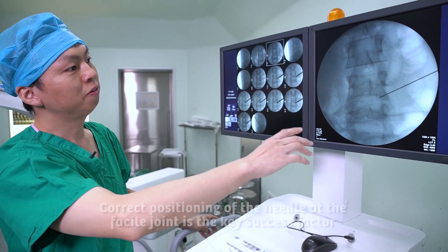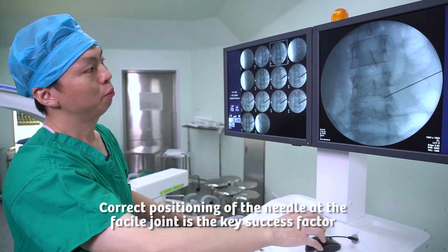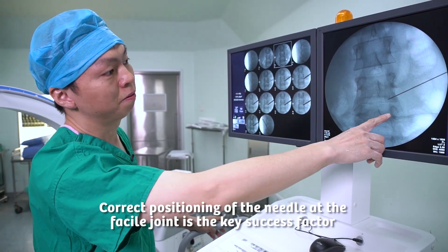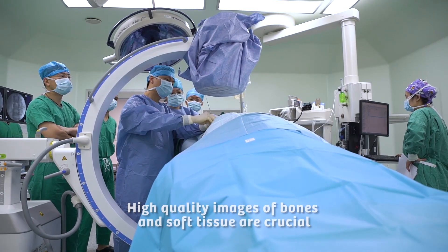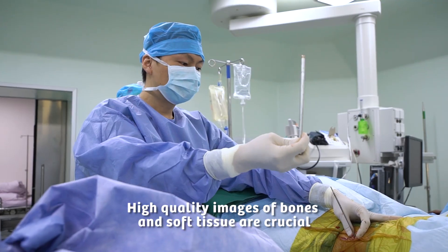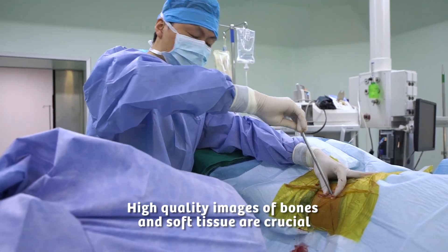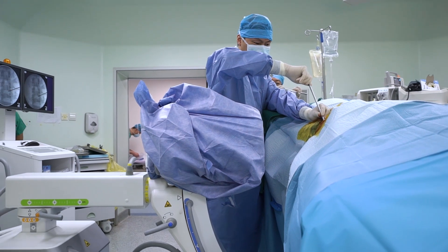In order to finish this kind of minimally invasive surgery, the first step we have to put a needle into the correct place — the facet joint, the tips of the facet joint. So we need a kind of machine to give us a clear, high-quality image to clarify the bone structure and soft structure, and help the doctor to identify the positions of this needle.